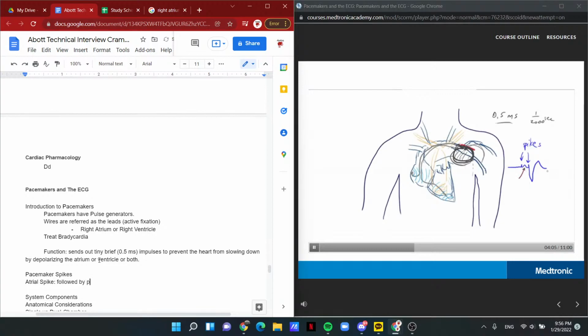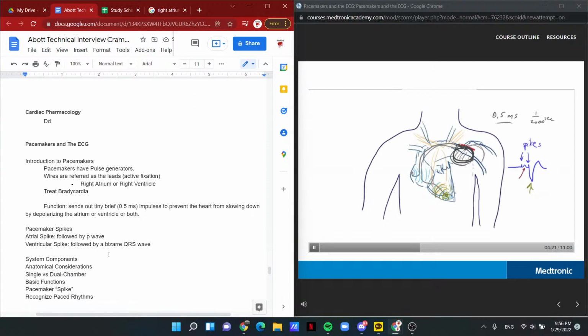And in the case of a ventricular pacemaker spike, you'll see a QRS complex. Keep in mind that the QRS originates from the tip of the wire, and so it's not going to follow the normal Purkinje system. Since the wires are inserted in the right ventricle, it will depolarize first, and the left ventricle will depolarize through slower intramyocardial pathways. And so the QRS complex will kind of resemble a left bundle branch block pattern, as I've drawn here in V1, with a broad QRS duration, predominantly negative in V1, with an upright T wave. And that's what you should be looking for after a pacemaker spike.